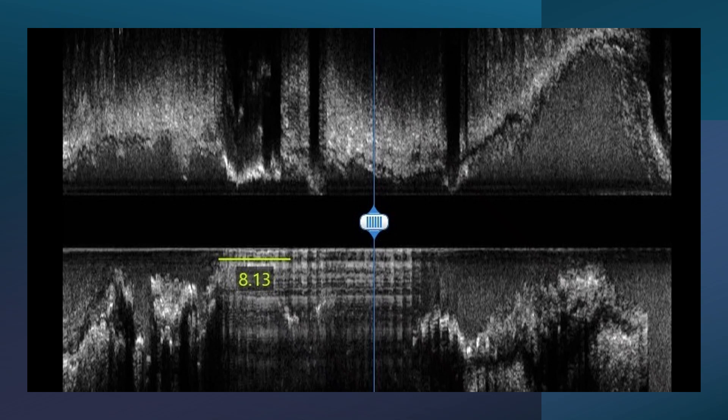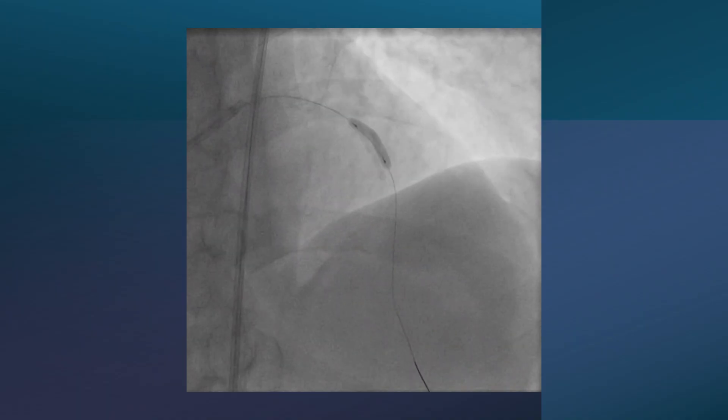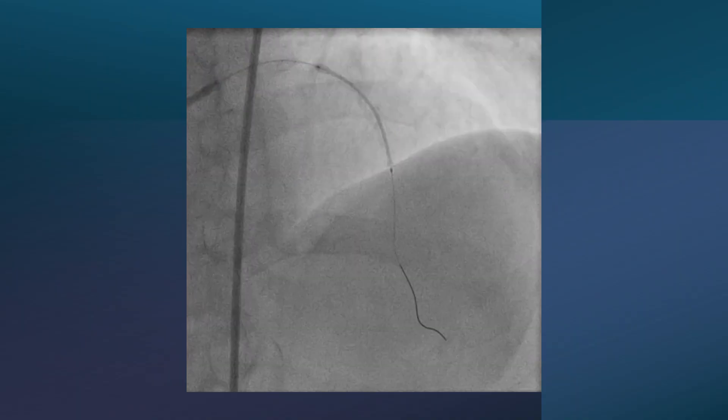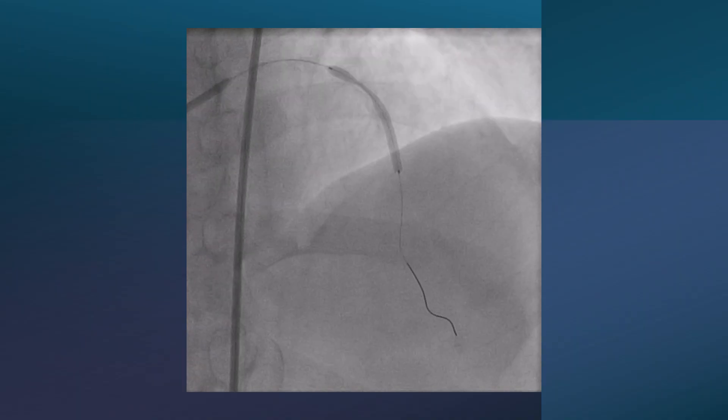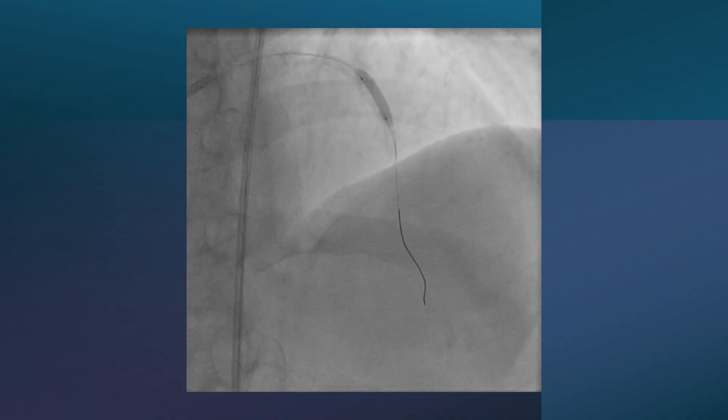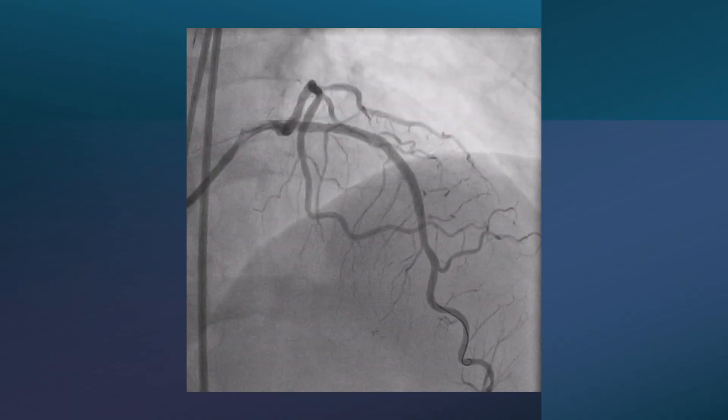After rotational atherectomy, we went to further prepare the lesion using a high-pressure balloon up to 20 to 22 atmospheres. The lesion became dilatable this time. The stent was then easily inflatable and deployed at the lesion. We post-dilated, and this is the final result.